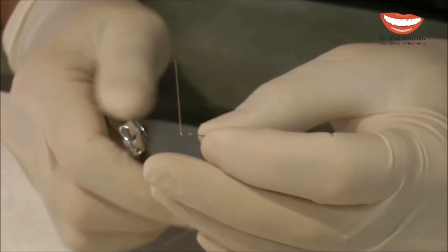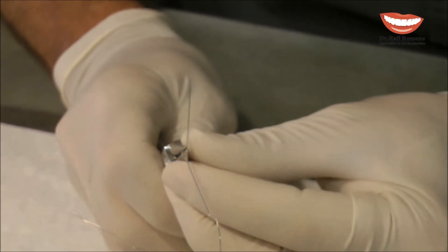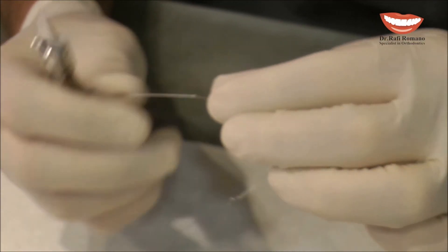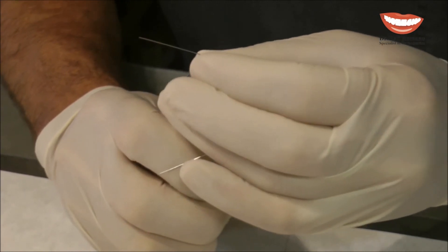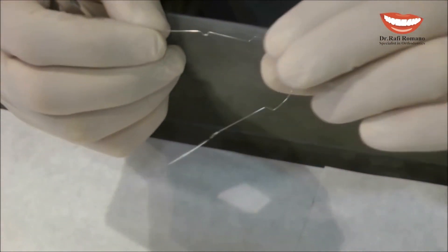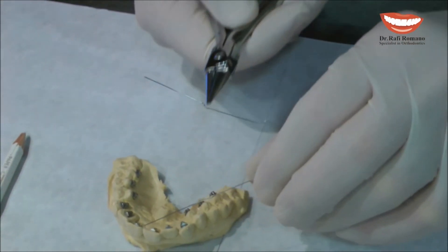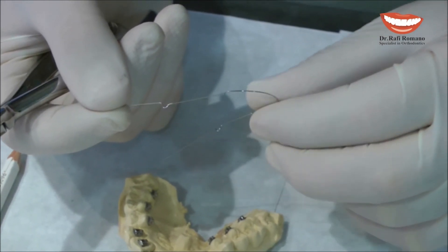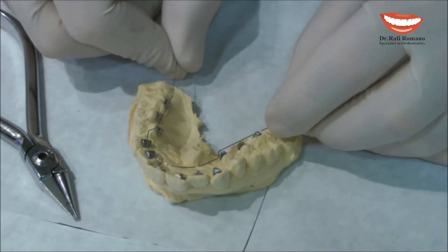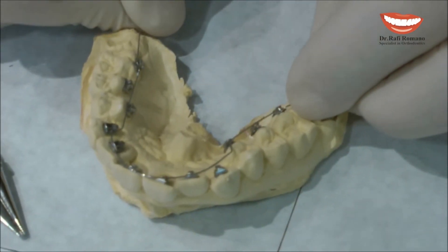Now we got the loop, and all we need to do is bend the wire back to the same level. Of course, the design plier made this bend more elegant than this one, but they both do the same work. So if you place the wire now with these two stops, you can see the amount of proclination that we can get.